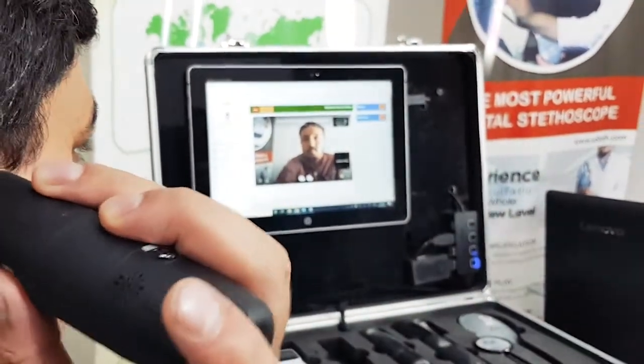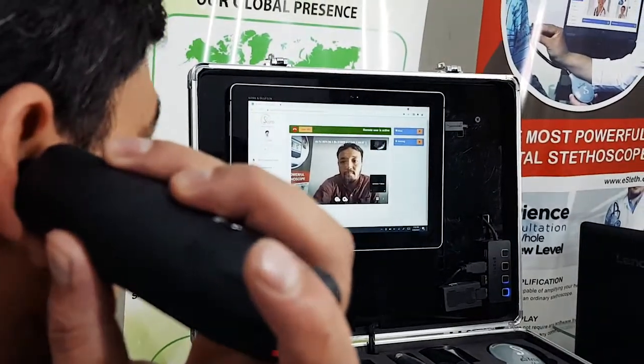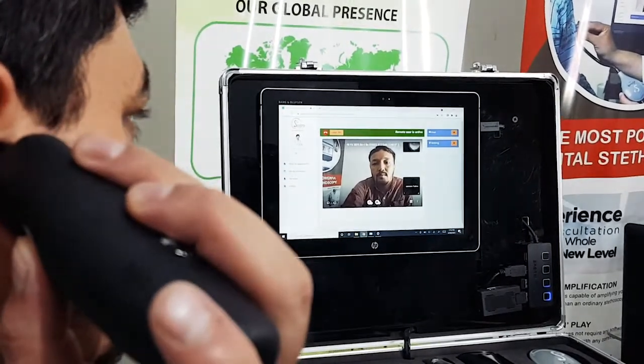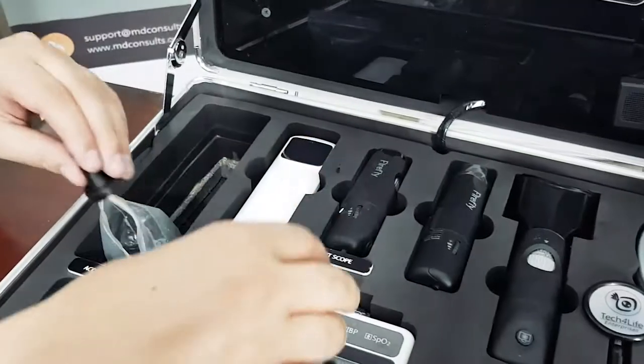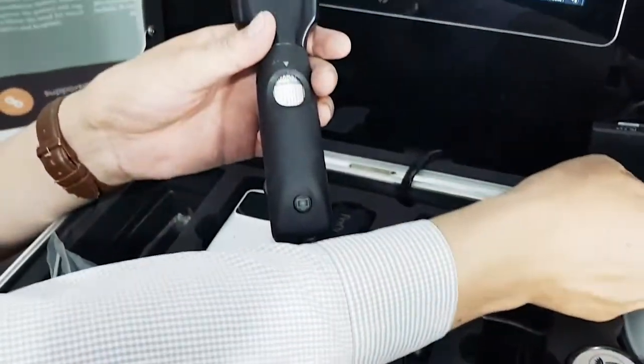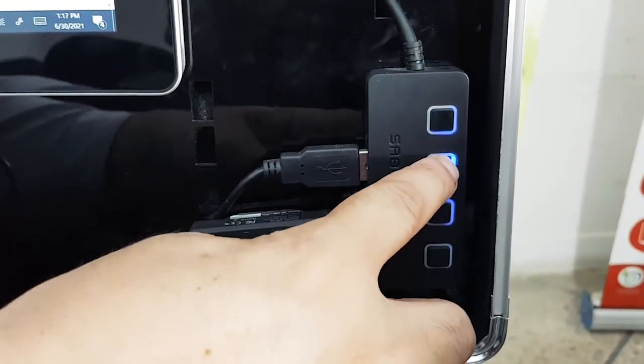When the otoscope is used in the patient's ear, the physician at the remote end can see the image and make a diagnosis. An iriscope is connected through the USB cable — turn on the switch for the iriscope.